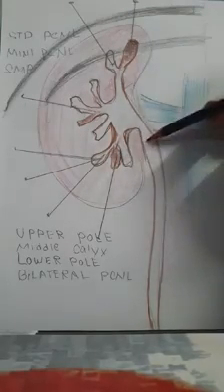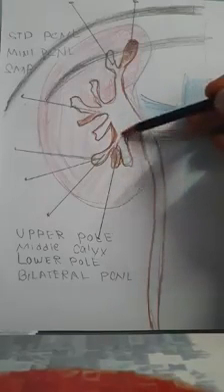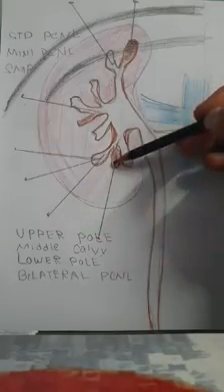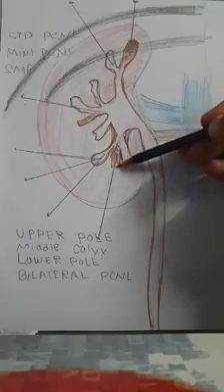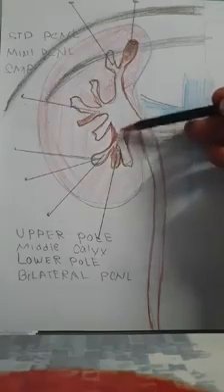Sometimes when doing it, the stone goes here, and I have to apply too much torque. It's very difficult to do that. So for that inferior pole, I use my super mini PCNL up to the stone, and use my laser, so that I don't have to, and there is less chance of stone migration.